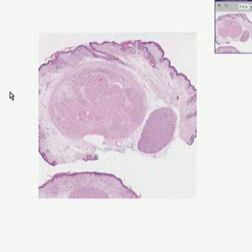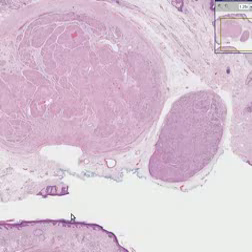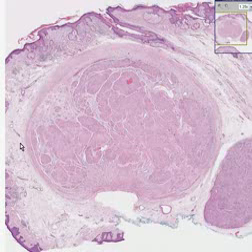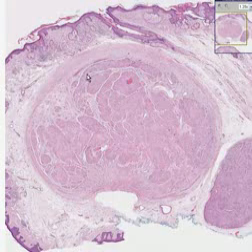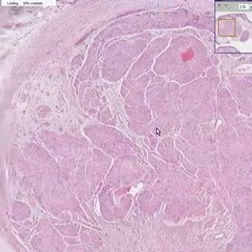Here is another skin tumor, primary to the skin. Notice once again the overlying epidermis looks pretty normal, looks pretty intact. Notice instantly that the so-called tumor in question does not involve in any way the epidermis, but this connective tissue of the dermis. And notice also that the tumor does not look epithelial. It looks spindly or perhaps of connective tissue origin.